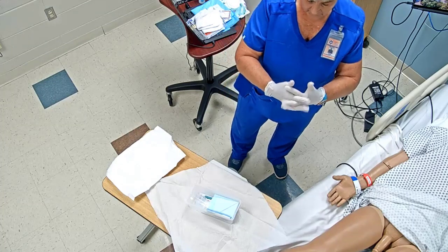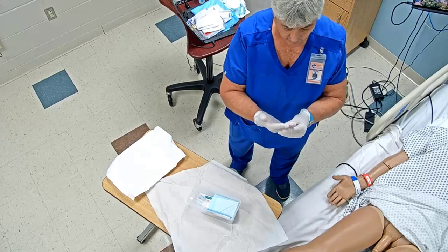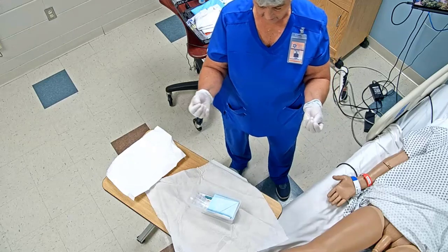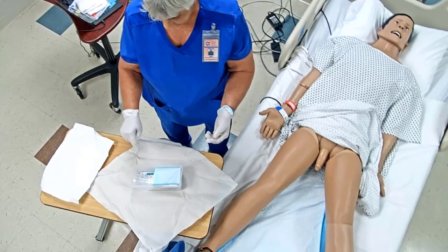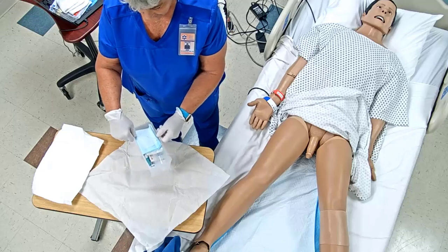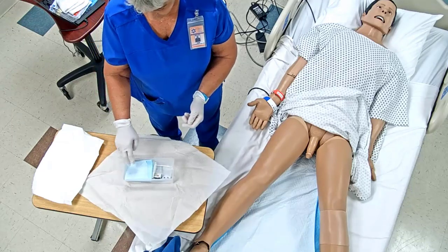Okay, you want to check to make sure the fingers are good below. That's why it's important that you have the right size gloves on. So I'm going to check the integrity. The integrity is fine. And so now I'm going to go ahead and reach in, knowing that I touched that part right there. I'm going to go ahead and just turn my tray around so I don't worry about touching that.